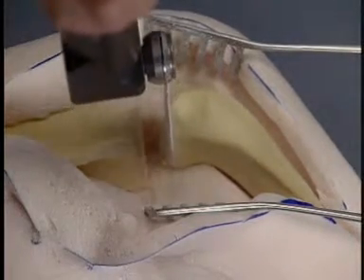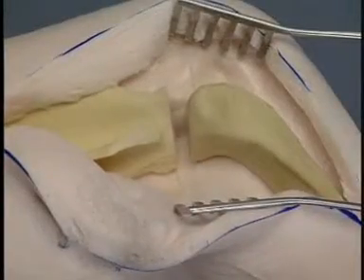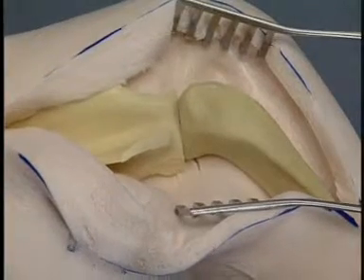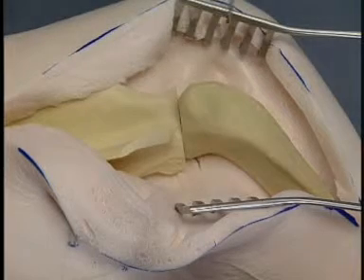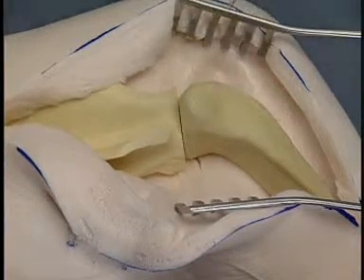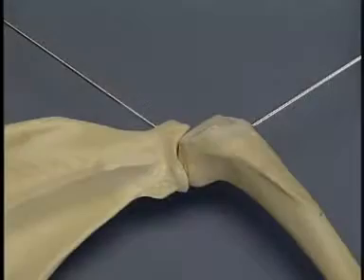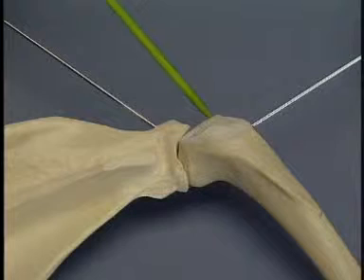Medial or lateral angulation of the ostectomy is to be avoided. The distal scapular and the proximal humeral ostectomy surfaces are opposed and temporarily fixed with Kirschner wires. An alternative technique is to remove only the cartilage from the glenoid surface and the humeral head.